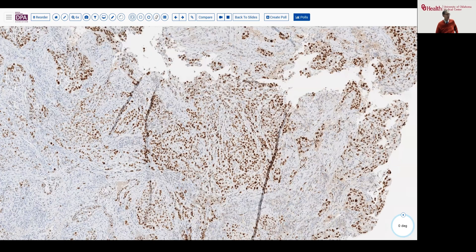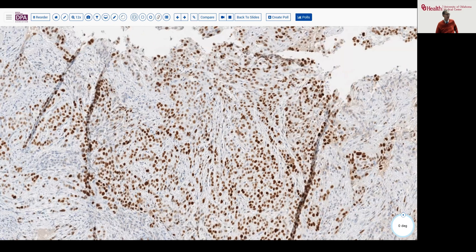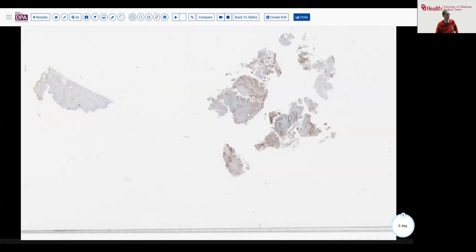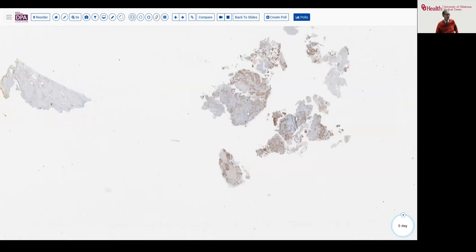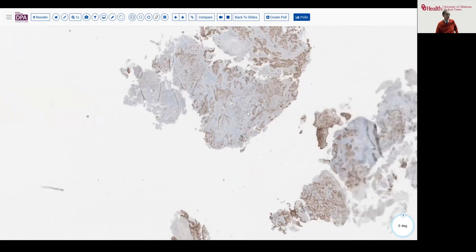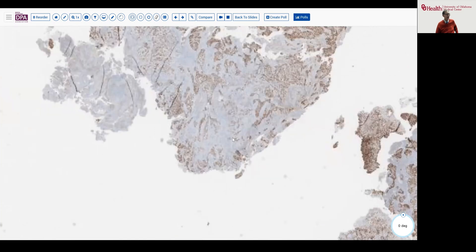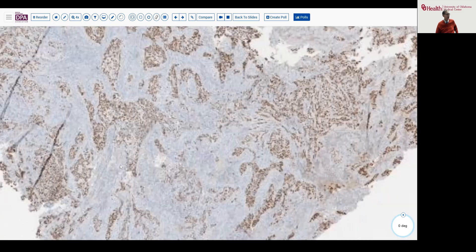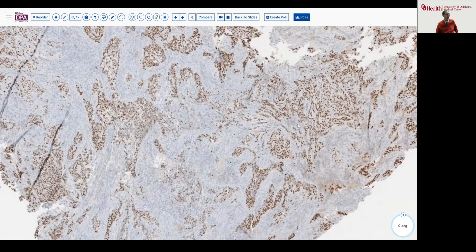P53 is a surrogate marker for TP53 mutation in tissue samples. It shows that this sample is quite uniformly P53 mutated, and hence unlikely to be positive for HPV. Here is our P63 stain, which also shows strikingly similar positivity, indicating entirely squamous differentiation in this tumor.